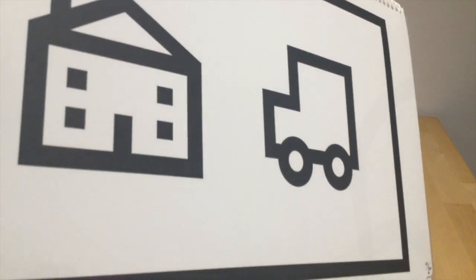So if I look across at the tab here, it tells me it's 30. So remember, we're doing this at 3 meters, so on the opposite side we've got the largest symbol. So I'm just going to flip it over and you can see, yes, that's looking pretty large. So that is what the child will see from 3 meters. We've got the house and the truck. And you can use that same key card as well.